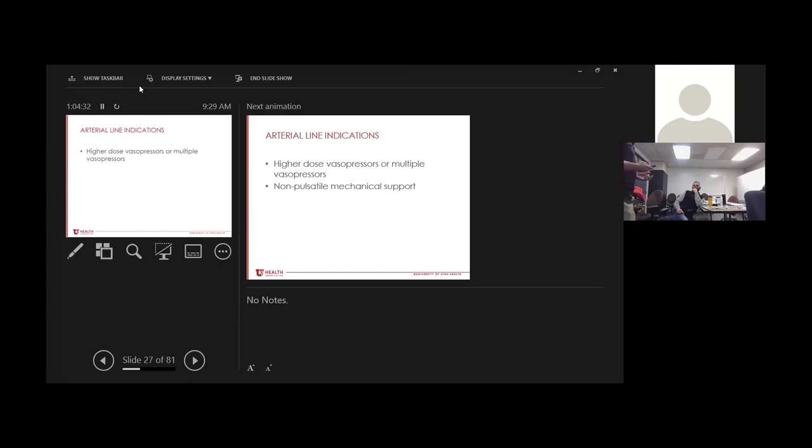Central lines, for medical patients especially, there's definitely circumstances where you might say, hey, I'd really like to take the time, if you can, to put a central line in. To the other extreme, like, hey, we can't leave without a central line. You know, it's nuanced. For someone with sepsis or something, yeah, you want to monitor that venous status. Most for flying, it's more about the access, right? If you have a central line, monitoring CVP can be a great tool, but you're not going to ask for a central line generally for that purpose, especially because we have ultrasound, which we'll get into.